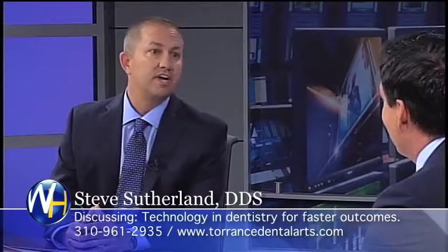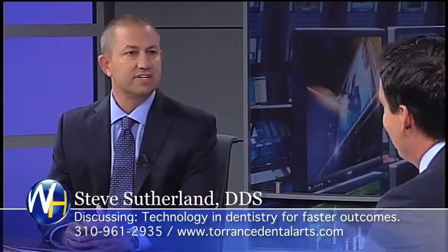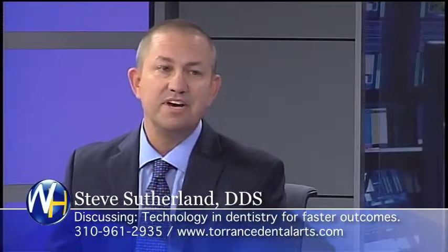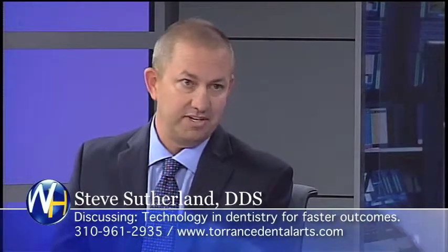And that's in your office? Yeah, right in the office. The milling machine, okay. In fact, the patients watch it as it's happening. We mill it out, and within about an hour, the tooth is customized and ready to go. And how soon can they eat and chew and do all that stuff? They can eat right away. They may be numb for a little while when they go home, but they can eat and chew, and it's completely done when we bond it into their mouth.